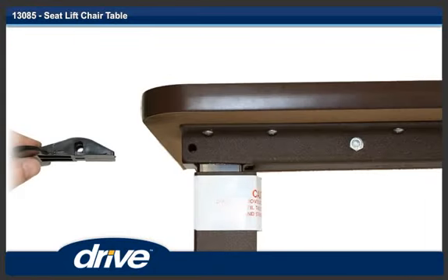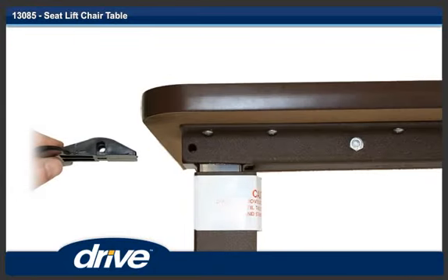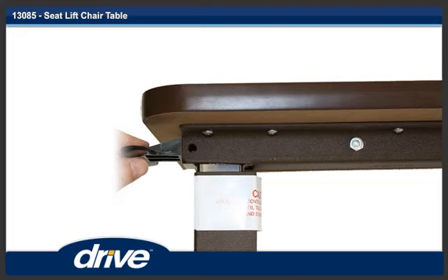Step 6. Insert the trip lever with the curved part facing towards the bottom of the table. Step 7. Align the holes in the trip lever with the holes in the tabletop and mast, and insert a bolt through the holes.